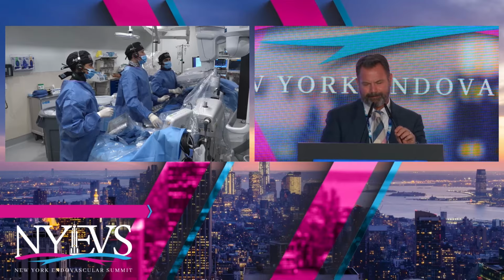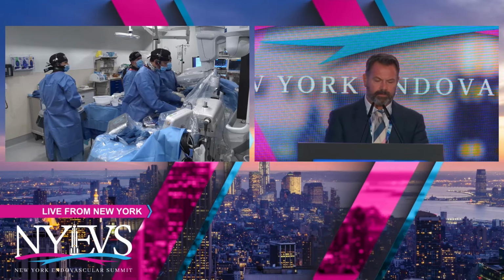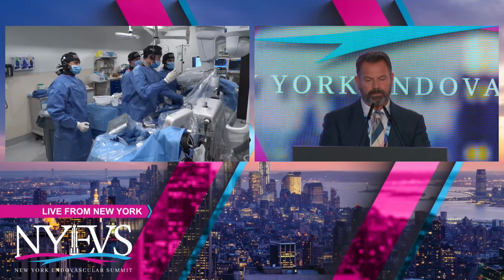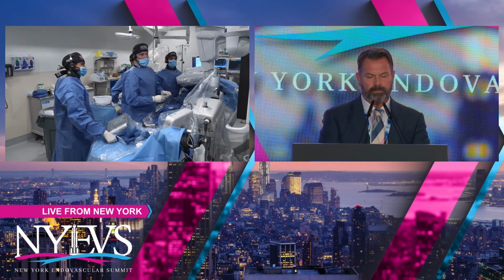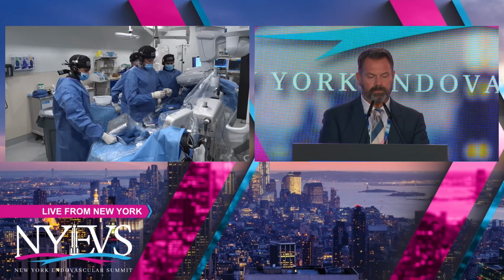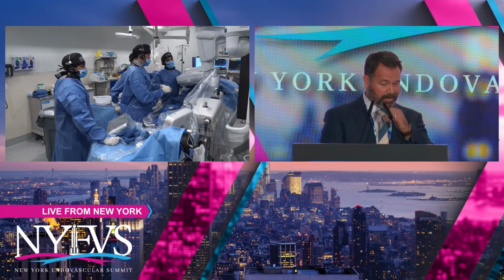George, let me show you, as a recap, the picture after the Rotarex thrombectomy. And like Dr. Zeller predicted, not much outflow. Some flow, if you see almost at the end, here it comes, but not as impressive as it should be.